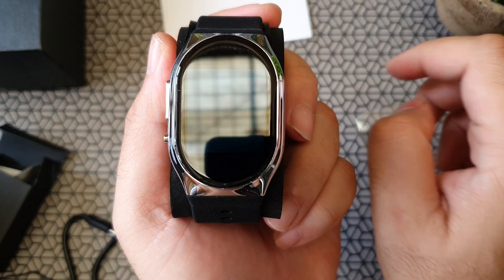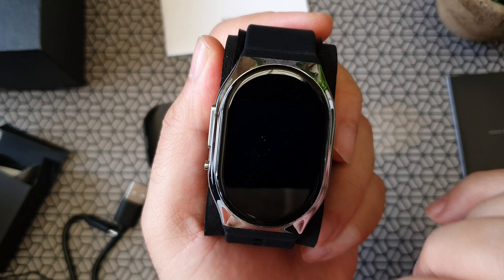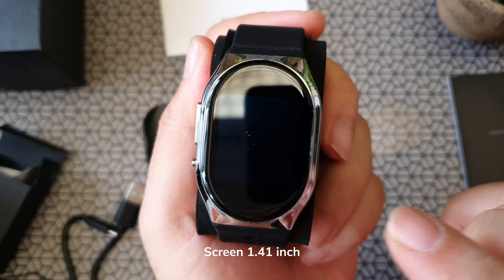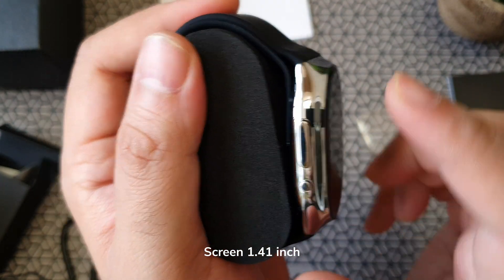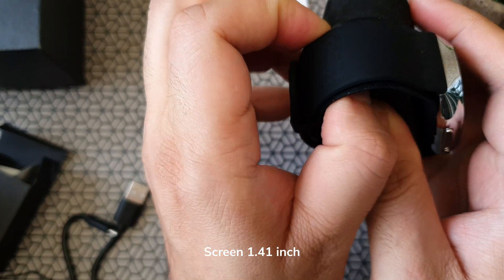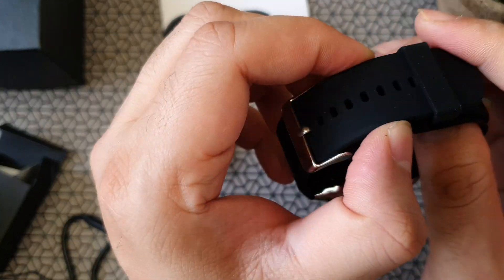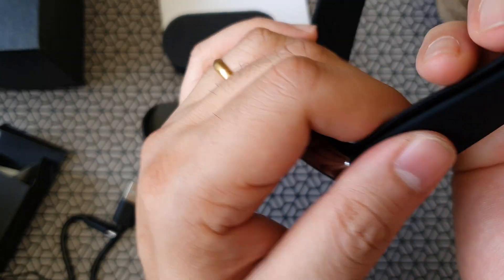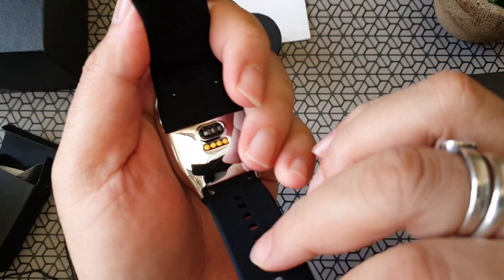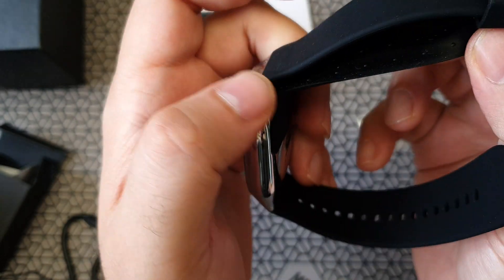Let's take off the screen protector. You can see it's actually a square display, about 1.41 inches diagonally, and it's an oval shape, but the screen is actually a square — or a slight rectangle — in the middle. This finish is actually nice. I like the TPU strap, it's really nice, and it's got a stainless steel finish on the watch.